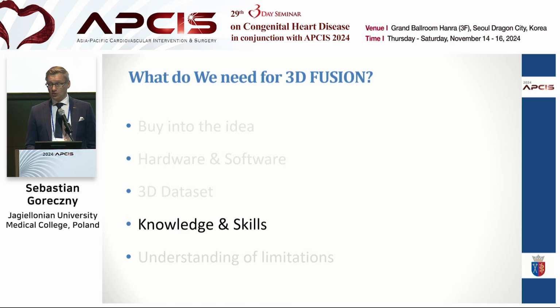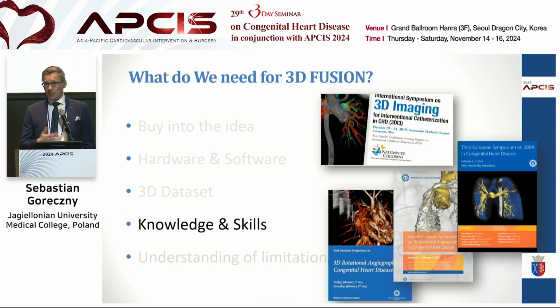And then knowledge and skills. There have been several focused meetings on 3D imaging for cardiac interventions. There were 3 in Europe, in Netherlands, and then several meetings in US. These meetings then joined other meetings, and now they work as sessions on big interventional meetings. And I guess there you can find information about how to use that imaging, and a lot of information there.